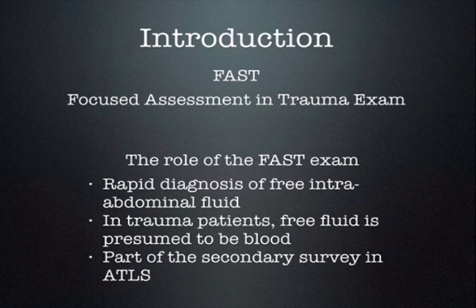So what does FAST exam stand for? FAST means Focused Assessment in the Trauma Exam. The role of the FAST exam is to rapidly diagnose free intra-abdominal fluid. In the trauma patient, we assume this free fluid to be blood. This may or may not be the case, as we'll see later. This is also part of the secondary survey in ATLS.